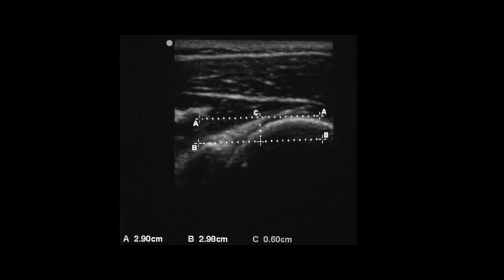One would normally expect to find the humeral head posterior to the glenoid rim. The step-off distance is the distance of the C-line segment. The C-line represents the distance between the A and B line segments that is tangent to the humerus and tangent to the glenoid rim.